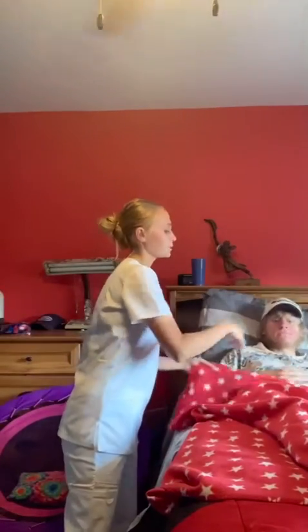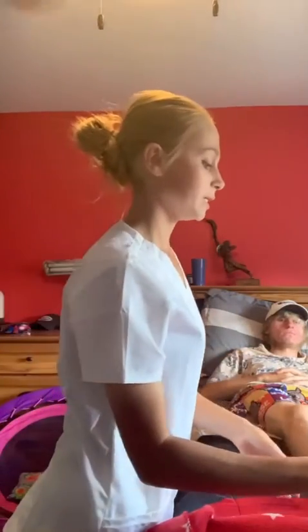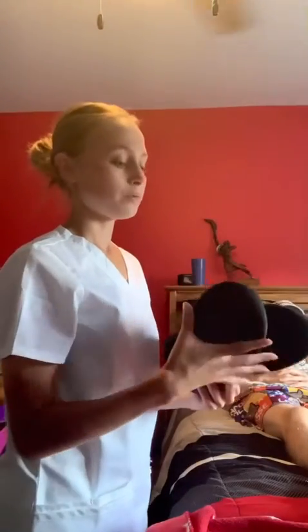And now I am going to take off my patient's top linen. So I'm just going to unfold it towards the edge of the bed. And now I am going to get the paper and put it underneath his feet. And this acts as a barrier from the linen to the non-skid footwear, just so the bed doesn't get dirty. So now I am going to be applying his non-skid footwear on him.